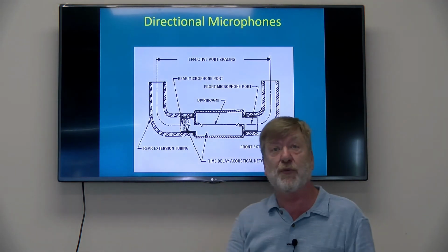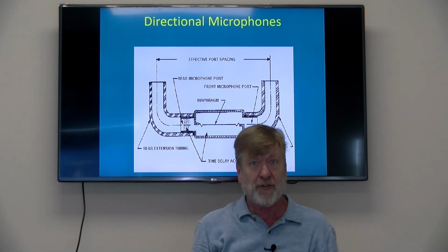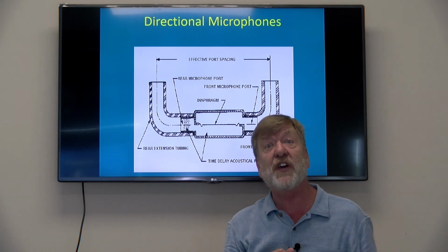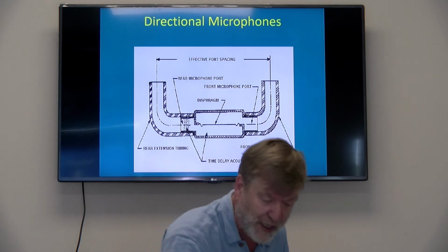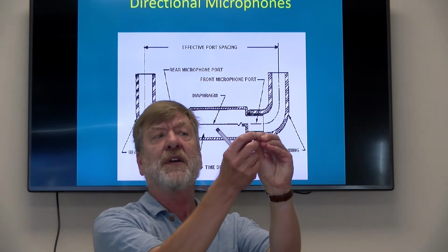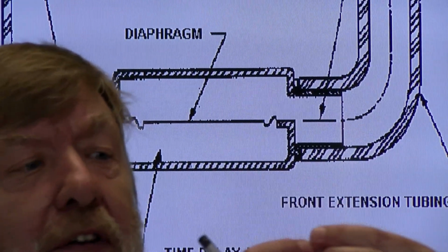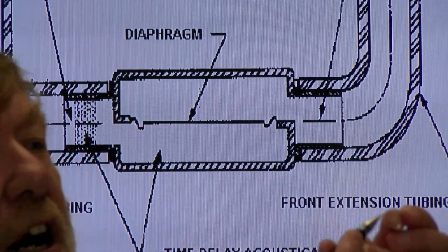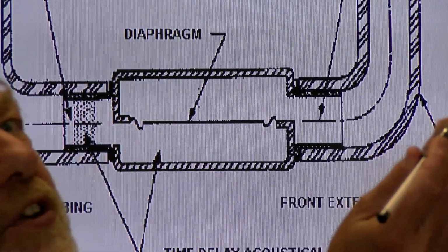Another way we do it is with directional microphones, so that hearing aids pick up sound in the direction you are facing. And we do that by having two little mics side by side. Now, I'm going to hold up a hearing aid and I'll try and point this out to you here. This is an in-the-ear hearing aid, okay? You can see that little wire, the little fishing line that I talked about in other videos. And when I show you this hearing aid, you'll see two little dots. One here and one here.